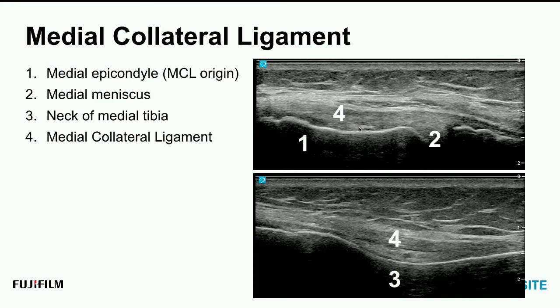And then this MCL, if you had a chance to look at the elbow webinar that we did, looks a lot like the UCL in the elbow. It's got this huge bugle, sail-shaped looking ligament fibers going across this medial epicondyle, which coincidentally is the same as the medial epicondyle of the elbow. Same shape, same geometry. Imagine that same ligament jumping over the humeral ulnar joint. In this case, we have the medial aspect of the knee joint where the femur and the tibia meet. Same shape, same appearance.